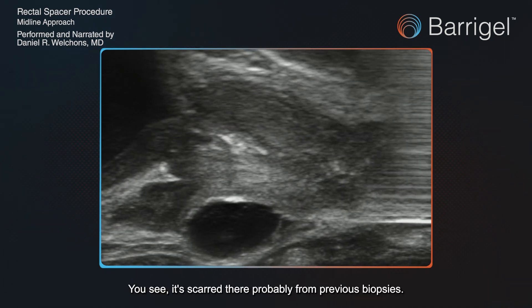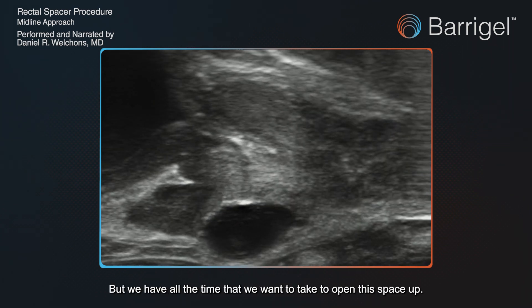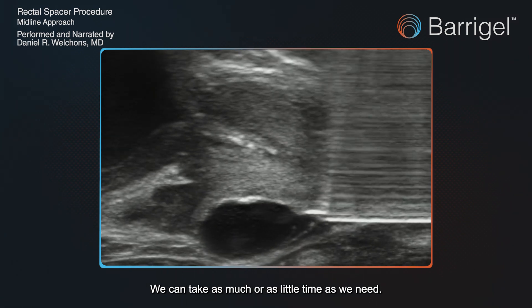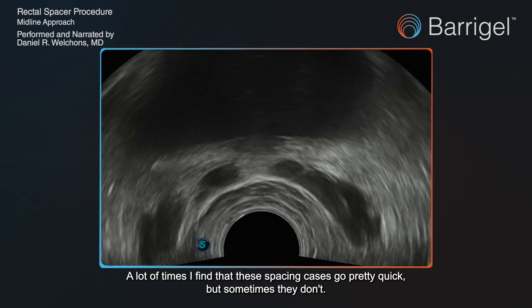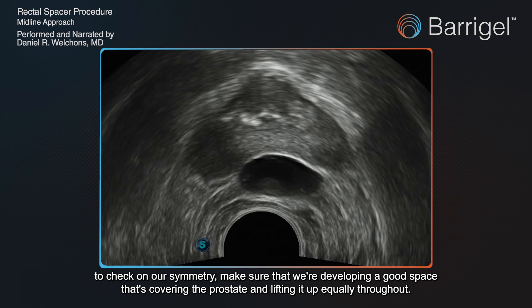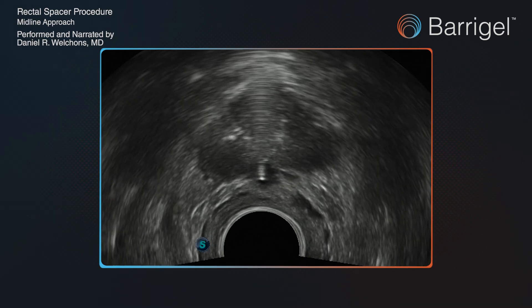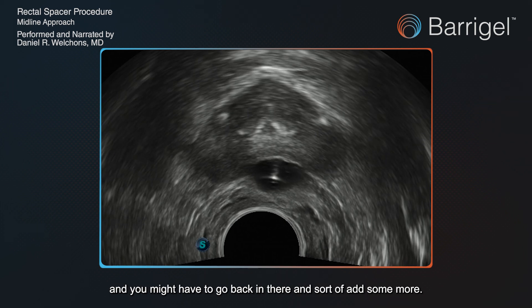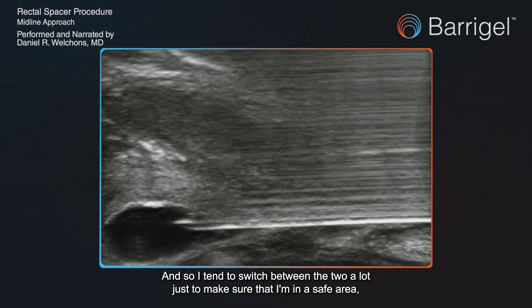Here's what I was talking about — you can see it's scarred there, probably from previous biopsies. That's not uncommon. We have all the time we need to open this space up. A lot of times these spacing cases go pretty quick, but sometimes they don't, and that's okay. We go back to the axial view to check on our symmetry, making sure we're developing a good space that's covering the prostate and lifting it up equally. Then you find the needle tip and identify where there might be a paucity of gel.